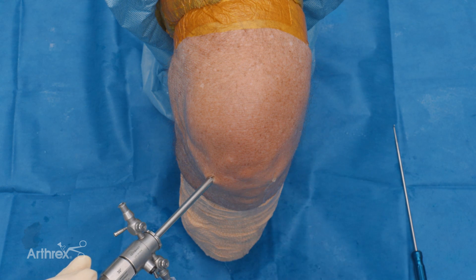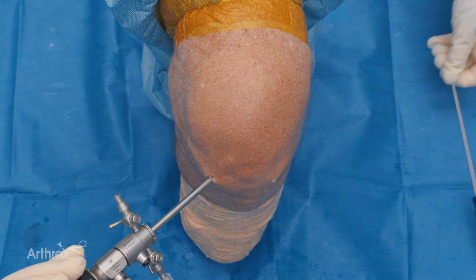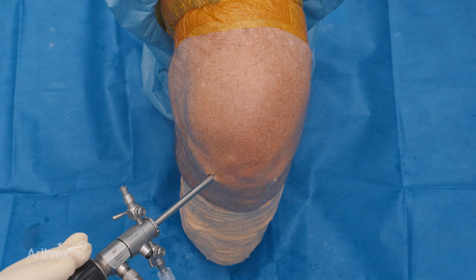I'm Dr. Walter Lowe from Houston, Texas, and today I'm going to show you a repair of a root equivalent type lateral meniscus tear in a left knee with the new 1.5 fiber stitch.